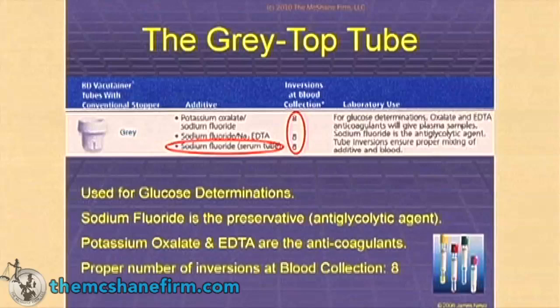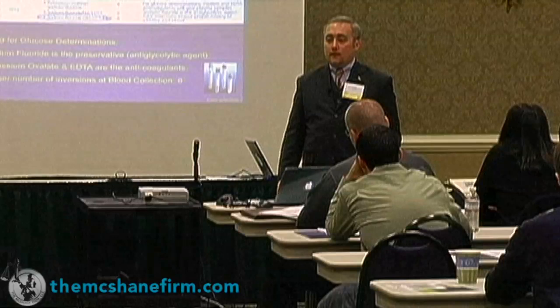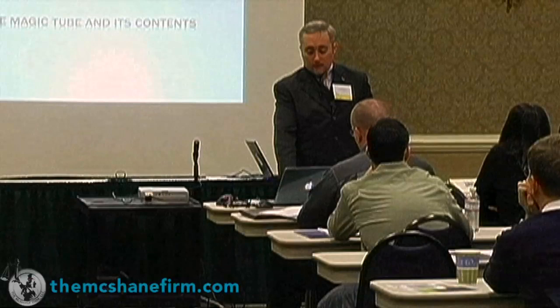So you have to just not accept, oh, it's a gray tube top, because there's different types of gray tube tops. One of them that's going around there, if you take a look at the label, it'll say sodium fluoride only. It doesn't have potassium oxalate. And that's going to be important because of clotting. Okay, so not all gray tube tops are the same. It requires 8 gentle inversions, which we'll go over here in a minute. So let's take a look at the magic tube and its contents.